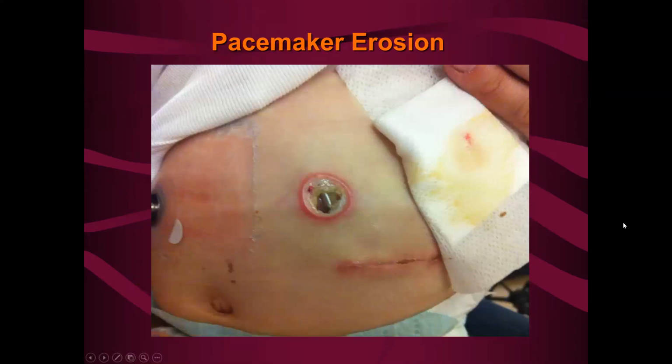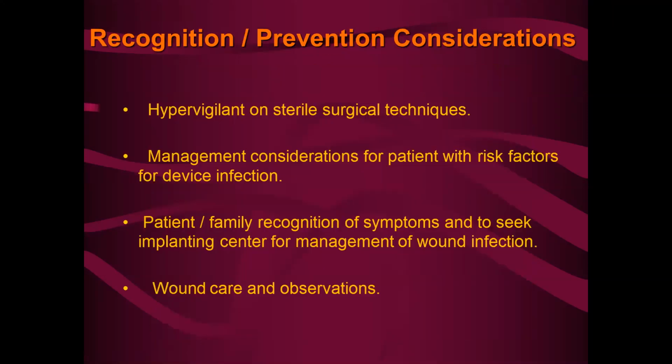But now at this point, when we can see the label that says Medtronic, it's too late, right? The whole system needs to come out, and it's also an increased length of stay for the patient to get treatment for the infection.